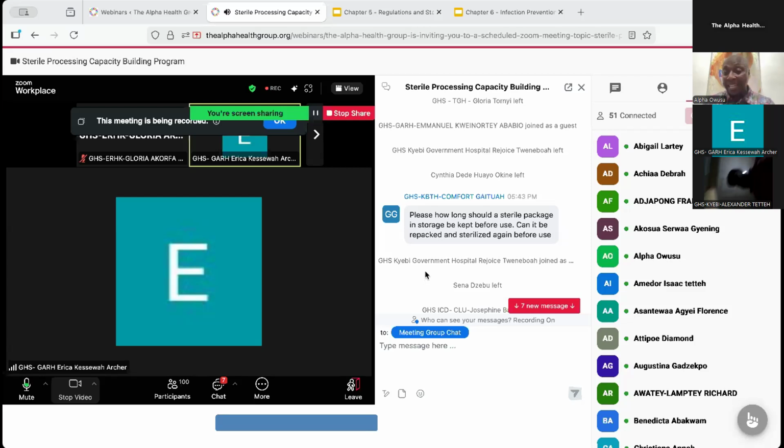I'm repeating because I have seen it before. We use sterile water. We will soak our towel, and after cleaning the surfaces of the instrument, we will go over the instrument and put it in the container. That will keep the instrument moist until it goes to the decontamination area.